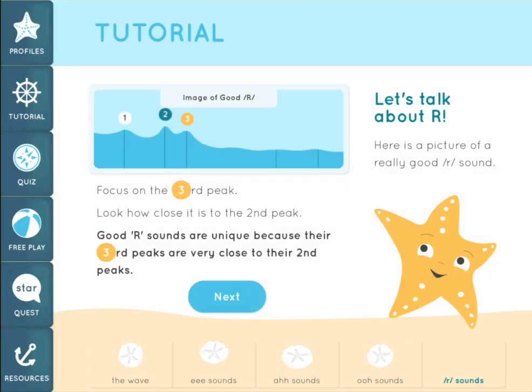Now let's talk about the R sound. Here is a picture of a really good R sound. For vowel sounds, we focus on the first and second peaks. For the R sound, our focus is actually on the third peak. Look how close it is to the second peak in the really good R sound. Good R sounds are unique because their third peaks are very close to their second peaks.